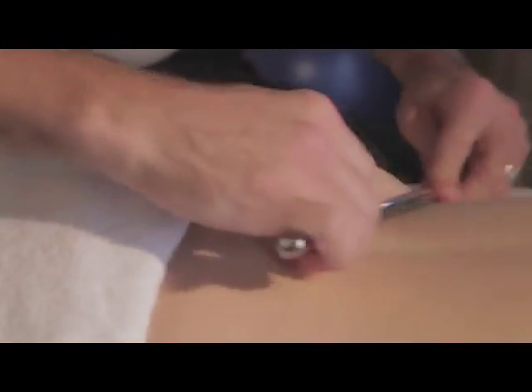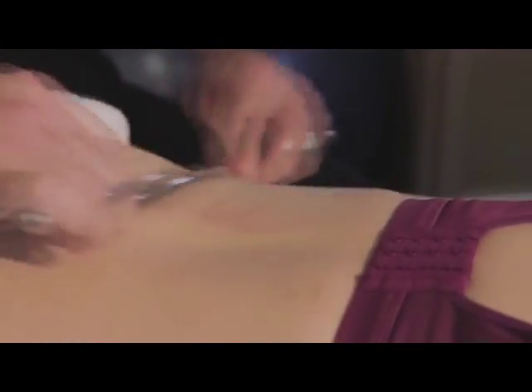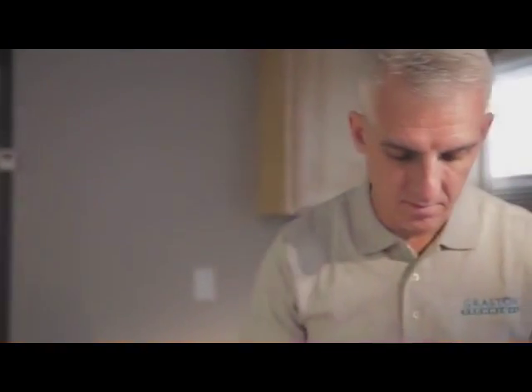If we are creating microtrauma or stimulating an inflammatory response, typically we'll treat those patients twice a week. The typical inflammatory stage will last 24 to 48 hours, and we like to have our patients work through that stage before we treat them again. So that typical patient we typically see maybe twice a week or maybe every second or third day.